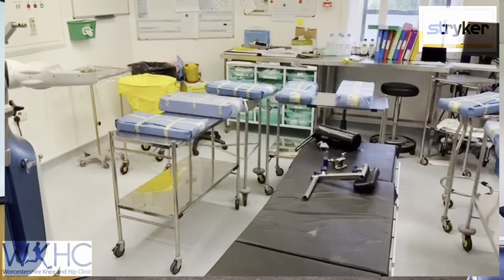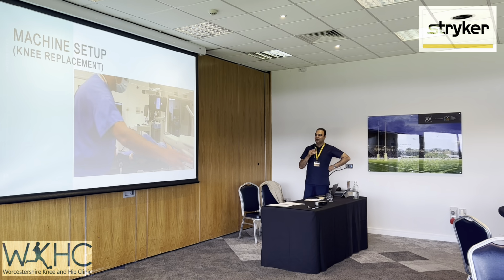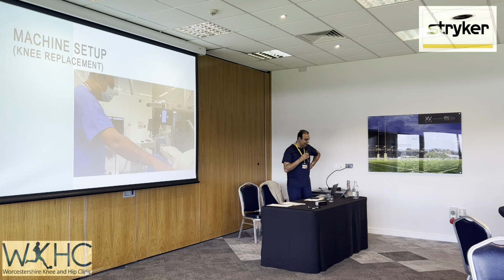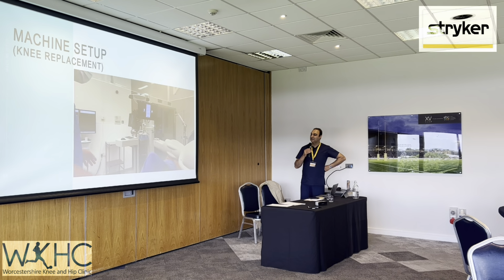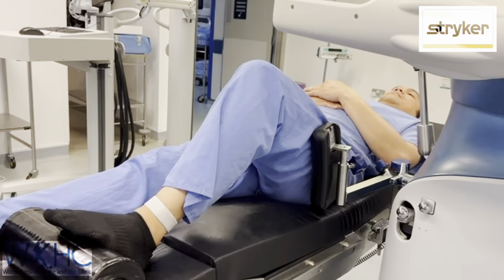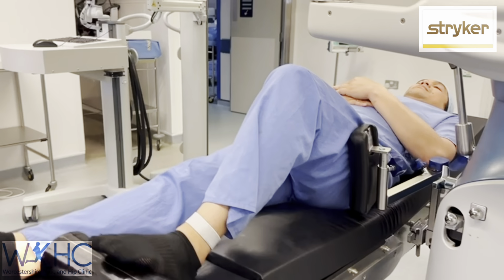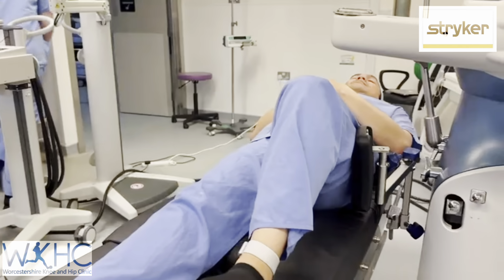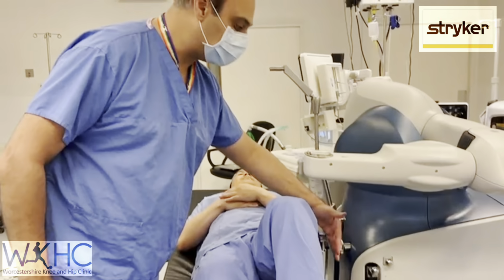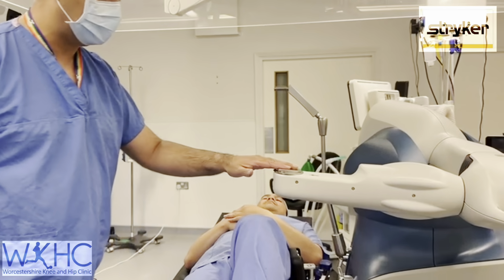Now, it took me a while to work this out. So we've got the same scrub nurse with his catheter bag on there. It took me a while to work out, because this robotic arm will cut out if you extend it or if you hyperflex it. So you've got to keep the arm at 90 degrees. So the robotic arm has to be just over the knee.